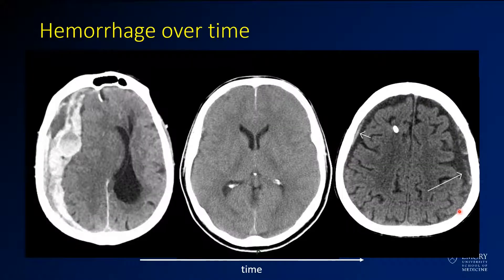Here you have an example of hemorrhage evolving over time. You have a big right-sided convexity subdural hematoma. Here you see it's at a very acute phase — it's very bright. The way this is windowed, it's almost as bright as the adjacent bone, although it's certainly not that dense. You see a lot of brightness in the extra-axial space and layers where the serum has collected off.